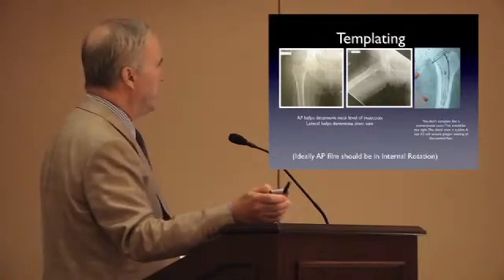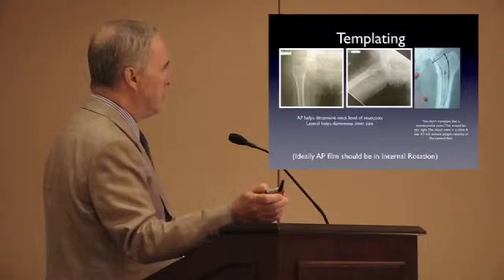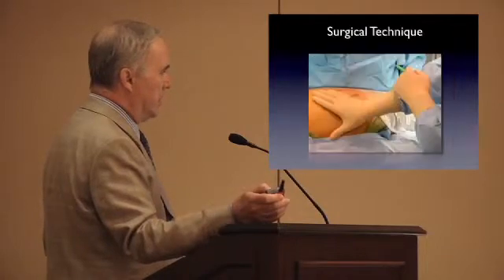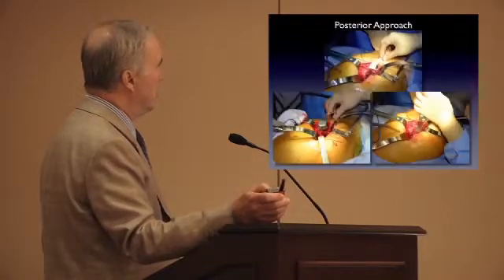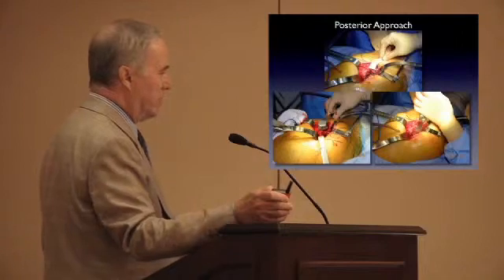If you want to get a good view of the medial calcar, internally rotate the hip if you can, about 20 degrees. It's a simple set of instruments. I use a posterior approach. My incision's about as wide as my hand is, and I don't need any special retractors or anything like that.